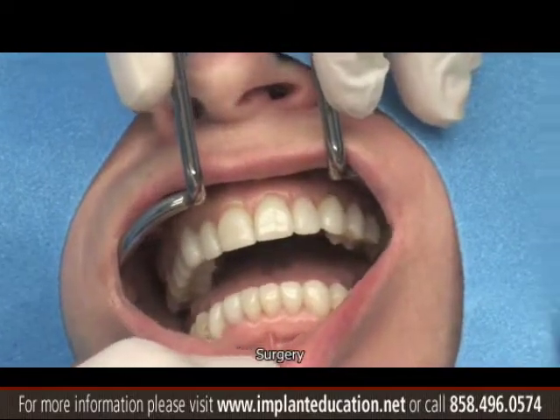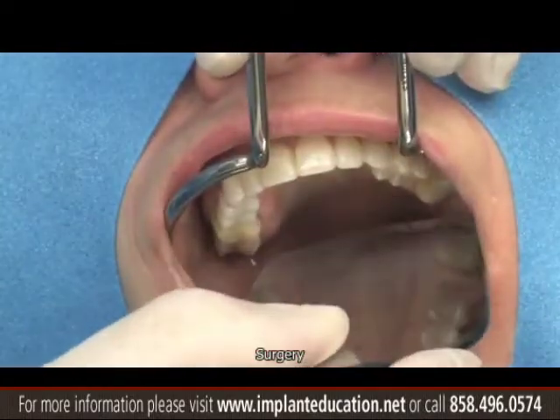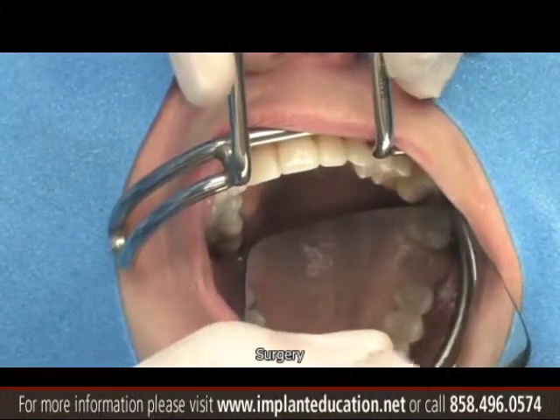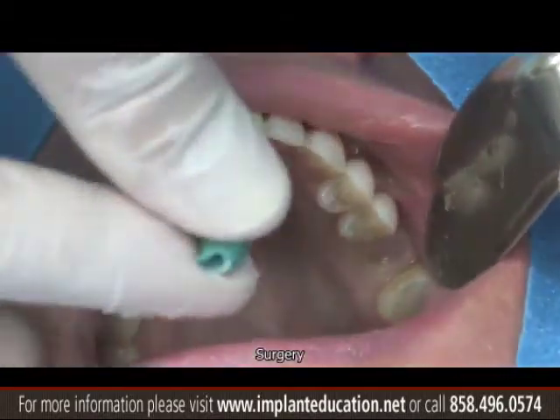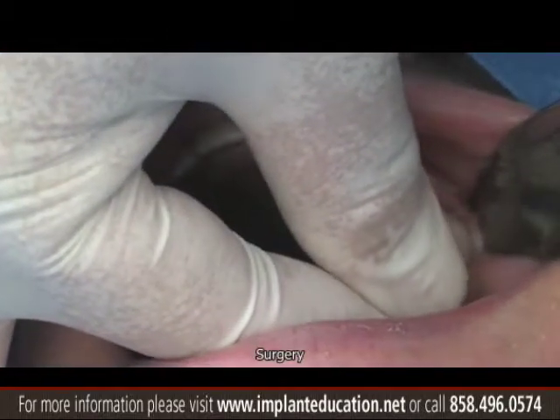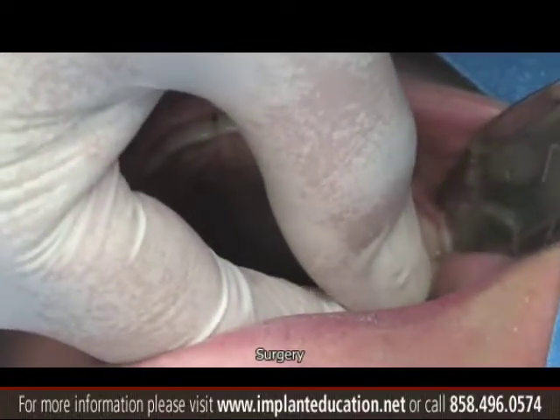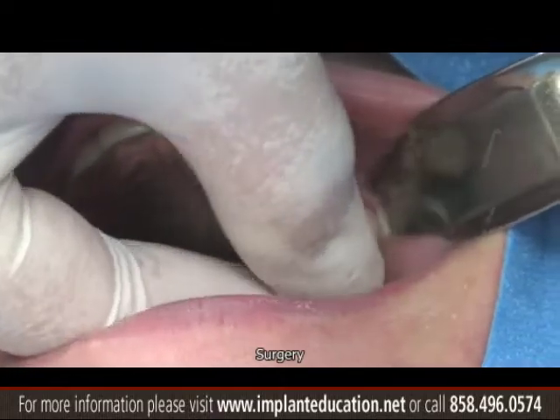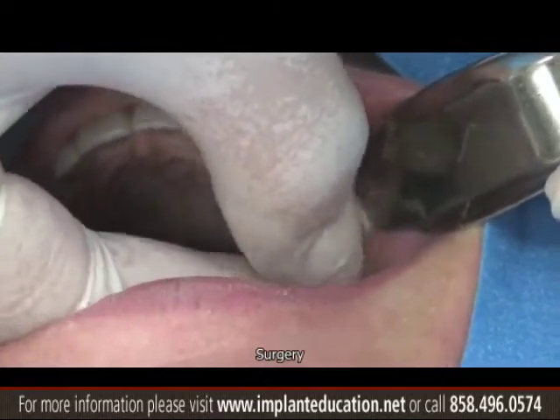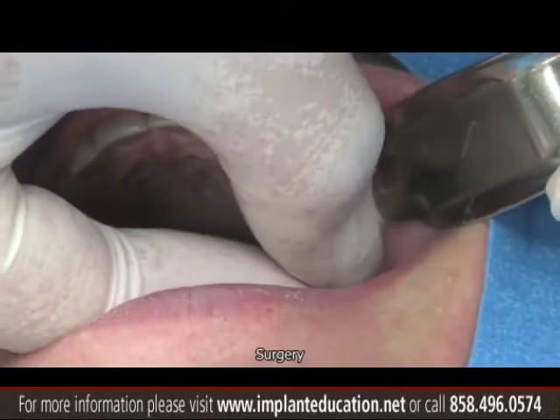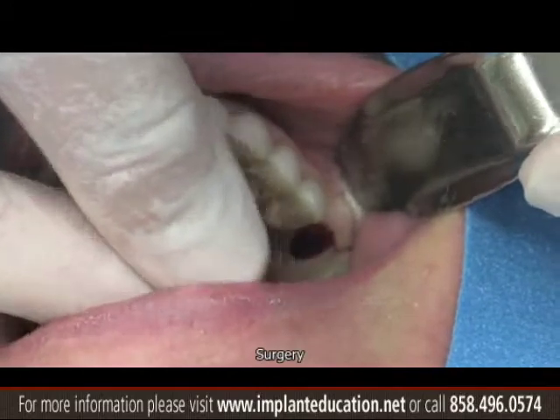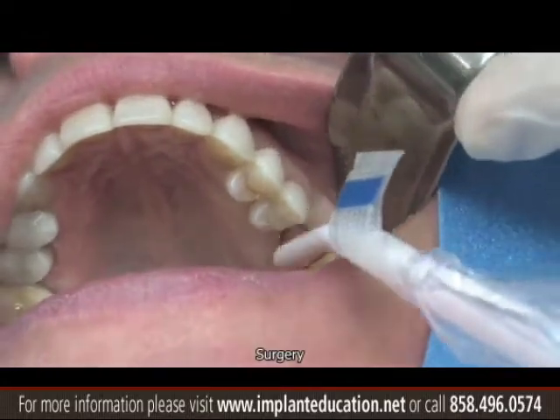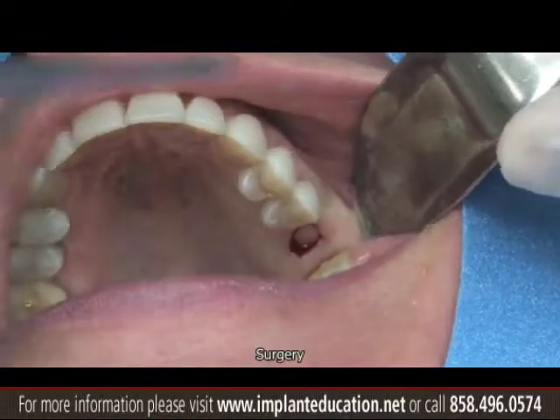The procedure starts — the patient did receive local anesthesia; no IV or oral sedation was used. We can see in the mirror the available width of the arch. We are going to use a flapless technique. After local anesthesia, I took a disposable tissue punch 4mm in diameter. You should use a tissue punch narrower than the planned implant — the implant is 5.3x10mm and the tissue punch selected is 4.0mm in diameter.